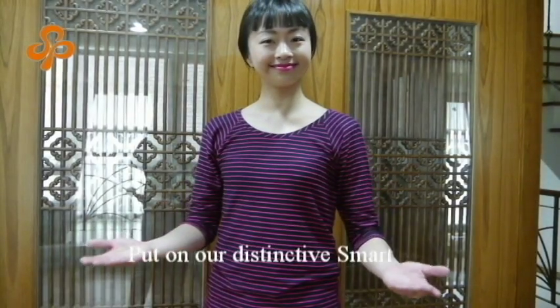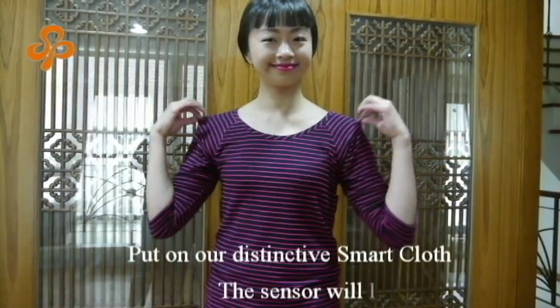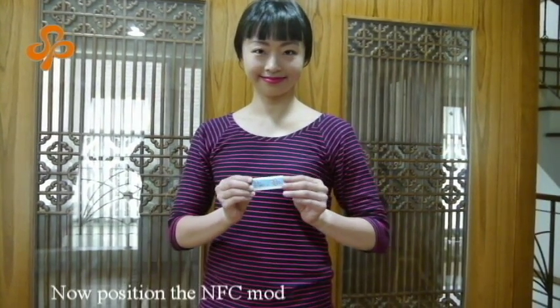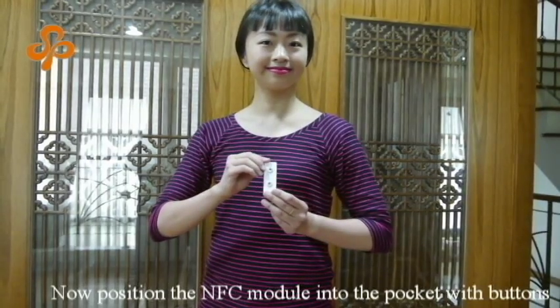Put on our distinctive smart clothes. The sensor will locate automatically. Now position the NFC module into the pocket with buttons.